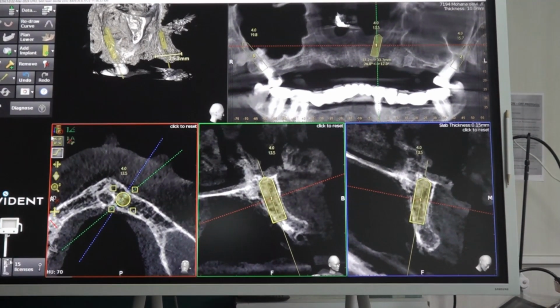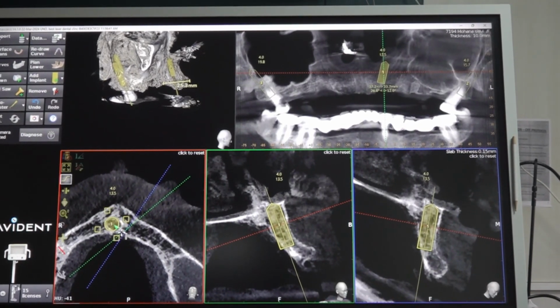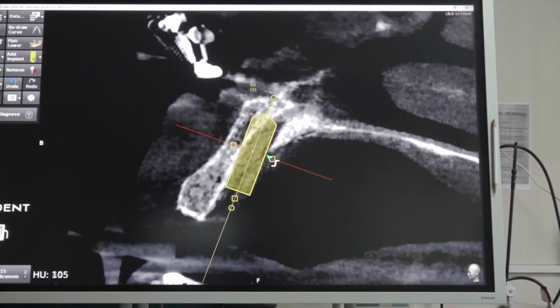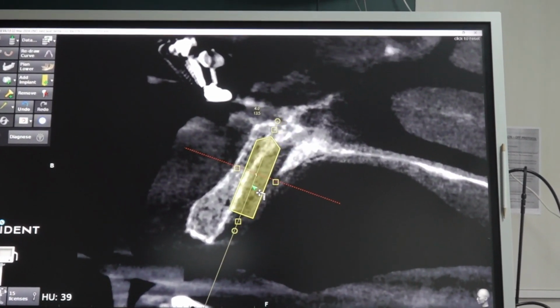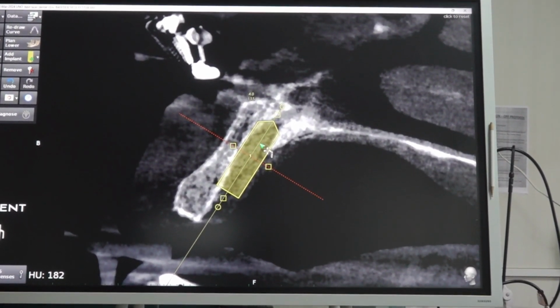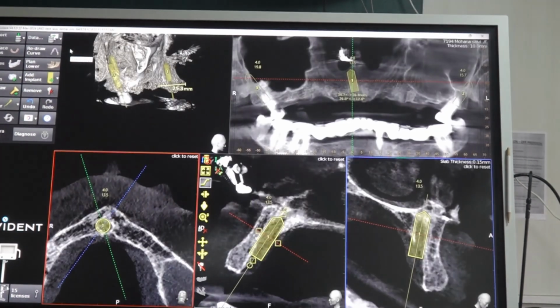Okay. So here also you can see the canal is quite big. Now what we are going to do is check the implant at the canal. It is not very big, right? Because there is bone here till here, but here no bone, only 3 to 4 mm is bone. And sometimes from here we can drill into the bone, that is also not favorable here. Here the bone thickness is anterior to the canal. How much bone thickness is there? It is not thick here. So trying a nasopalatine implant is not a good idea.